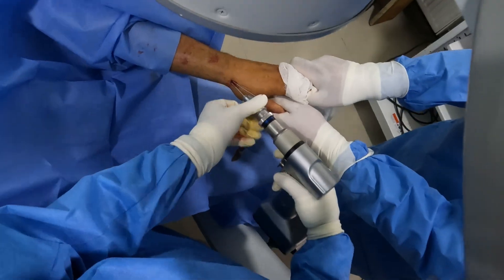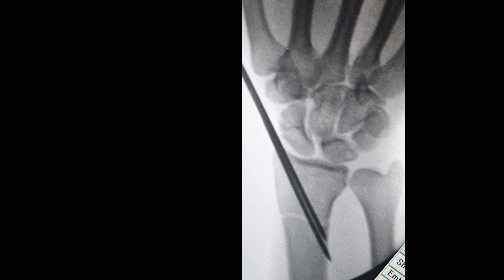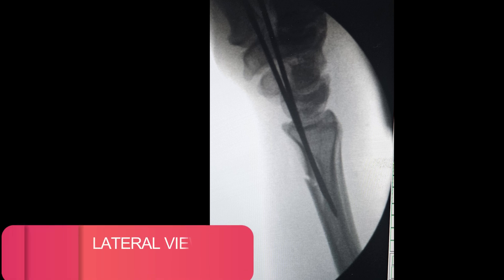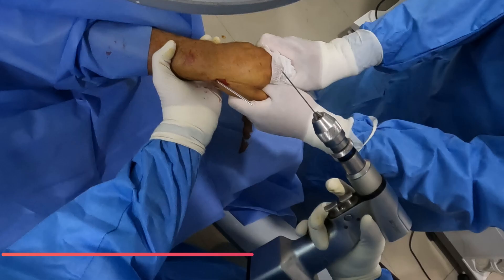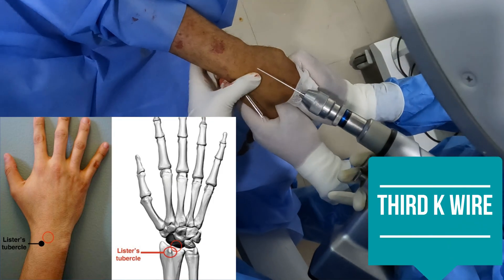I'll take the AP view of the patient. Here you can see two K-wires coming across the radial styloid and passing across the fracture site. I'll take the lateral view — here you can see that in the lateral view as well, both K-wires are inside the radius. The third wire I'm going to place is through Lister's tubercle.